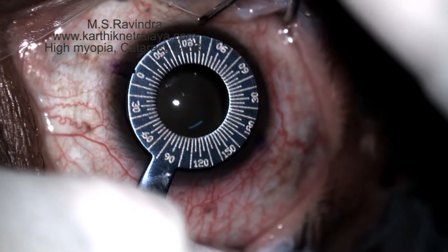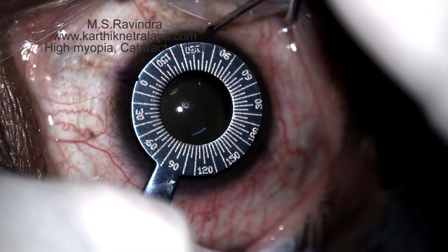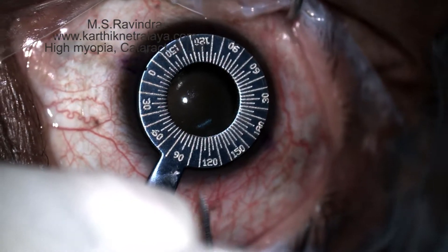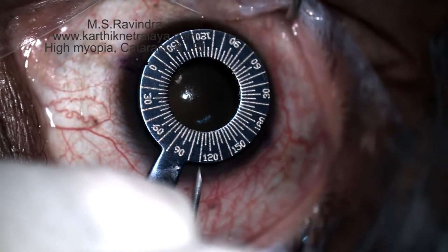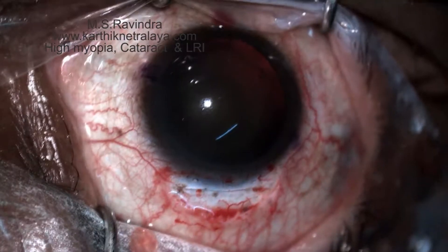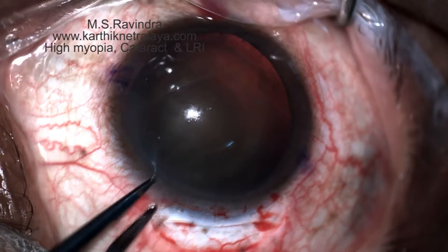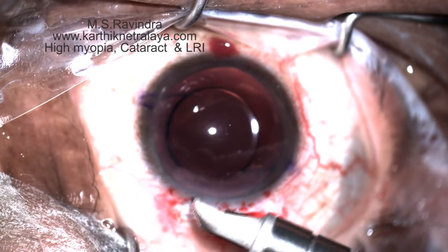Cataract eye surgery with LRI is being performed. Marks are made at 110 degrees, which is the steep axis. The patient has two diopters of corneal astigmatism. The tunnel incision is created centered at 110 degrees.